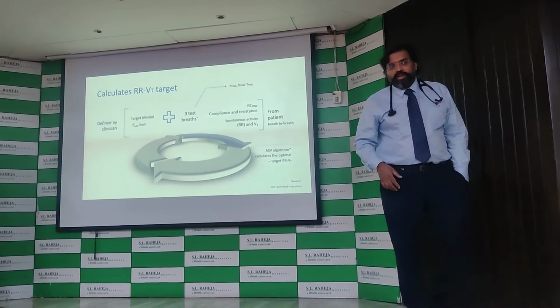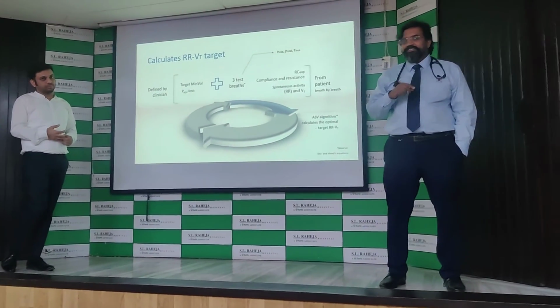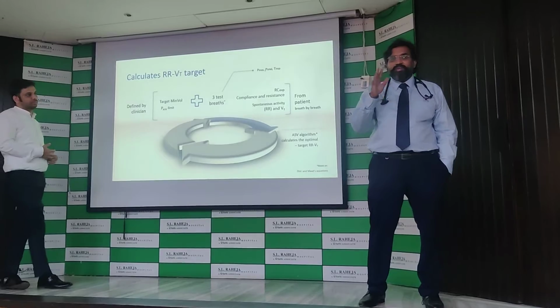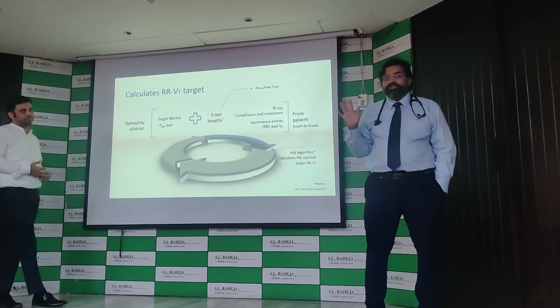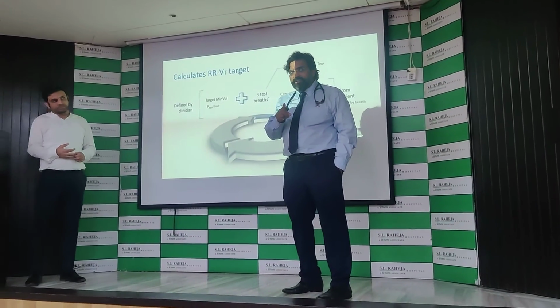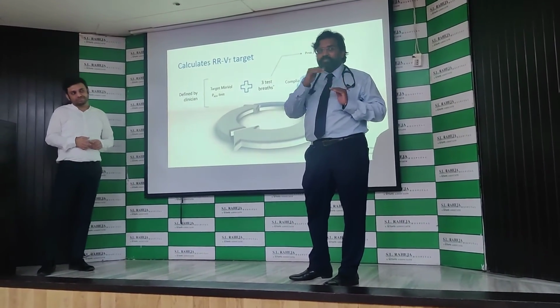No, we don't need to change that. We will never be changing that. In adaptive support ventilation, I am not changing anything based on that graph. That graph is only telling me that the ventilator is doing its job. The ventilator does everything to get the plus into the box.